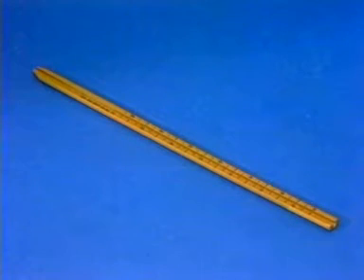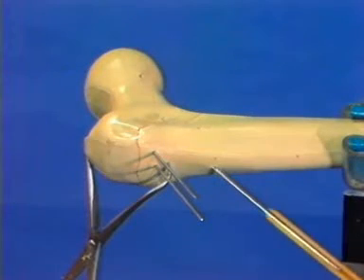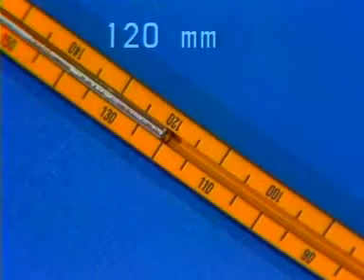The DHS direct measuring device is now selected and placed over the end of the guide pin. The measuring device shows the length of the portion of the guide pin which has been drilled into the bone. Here it shows 120 millimeters. That means that the distance from the lateral cortex to the joint surface, in this case, amounts to 120 millimeters.